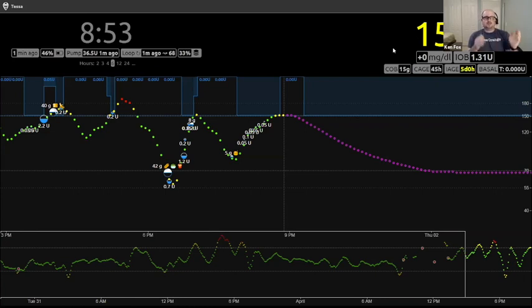So if it missed it at that 5-minute mark, like let's say Dexcom hadn't uploaded it to Share just yet, like it's off by 30 seconds or so, it's not going to try again, sorry, for 2.5 minutes. So that means if you missed it at minute 0 or minute 1, it's not going to try again until 2.5 minutes into that 5-minute reading cycle. So you might always be 2.5 minutes behind looking at your CGM value. And especially when you're watching a kid, it gets rather annoying.